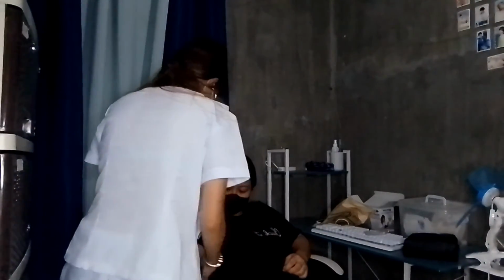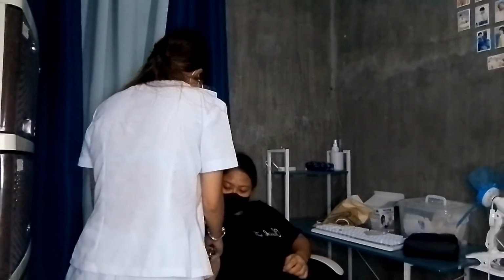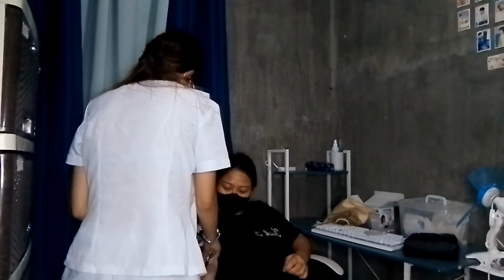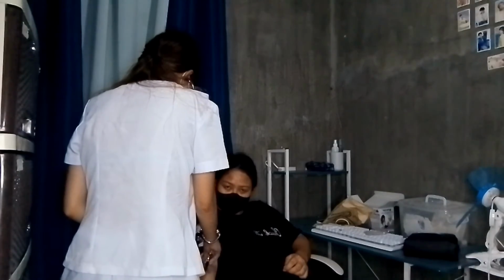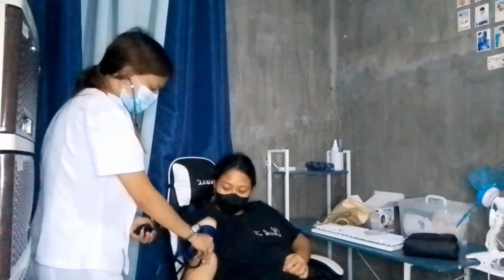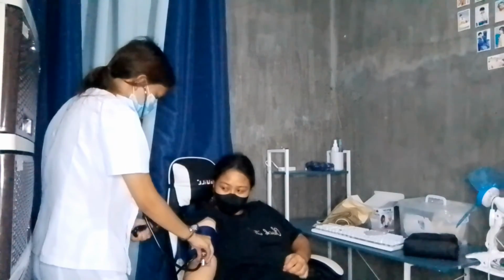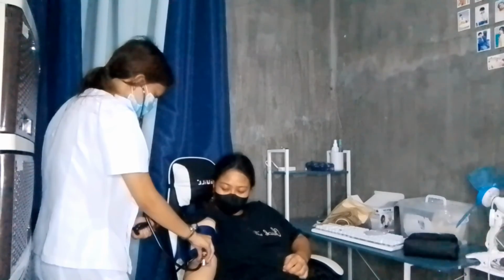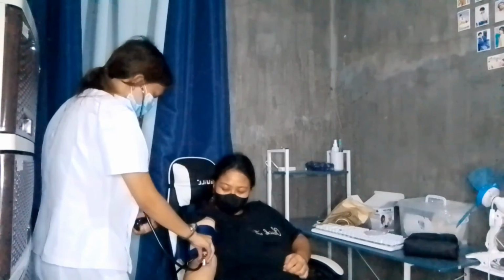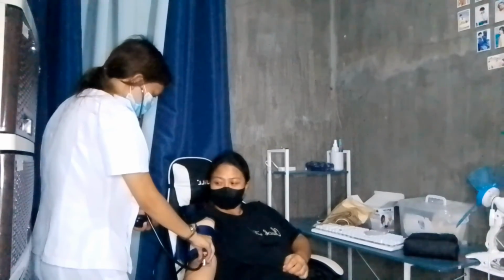Wrap the deflated cuff evenly around the upper arm. Locate the brachial artery. Apply the center of the bladder directly over the artery. If this is the client's initial examination, perform a preliminary palpatory determination of systolic pressure. Position the stethoscope appropriately. Auscultate the client's blood pressure.